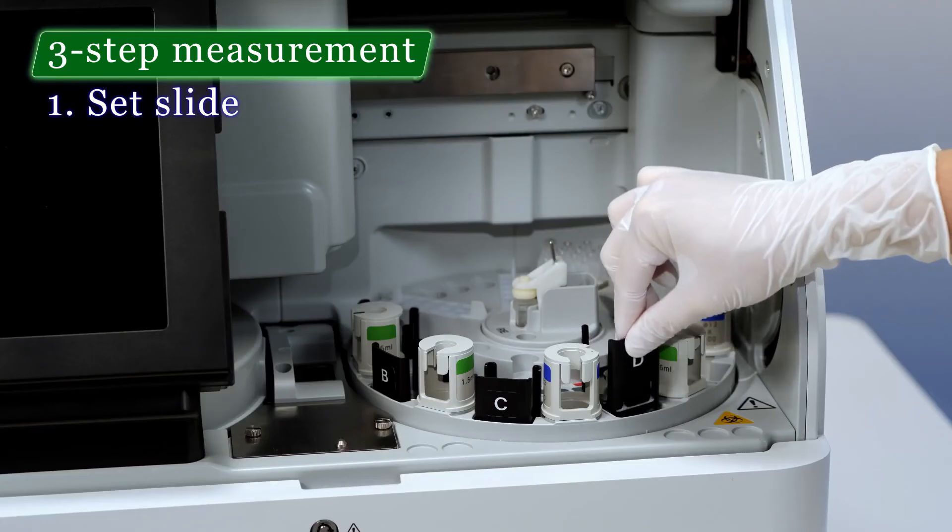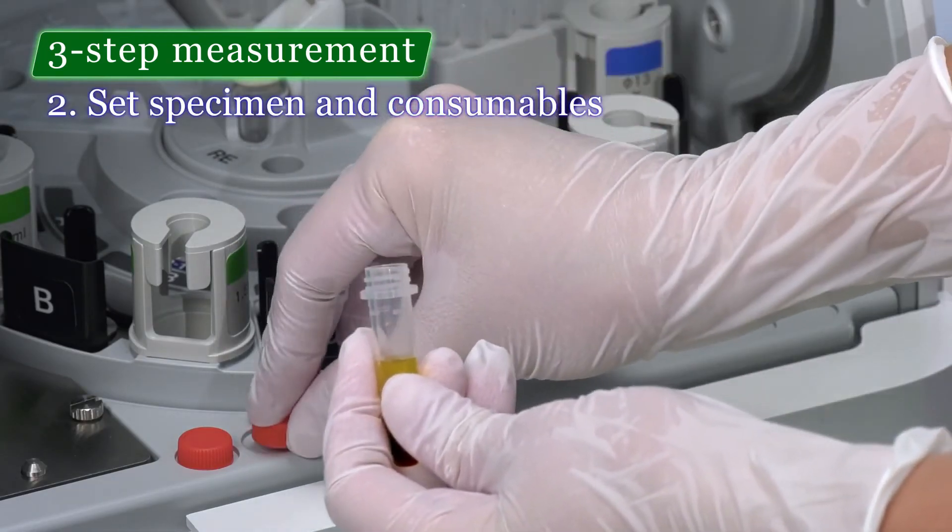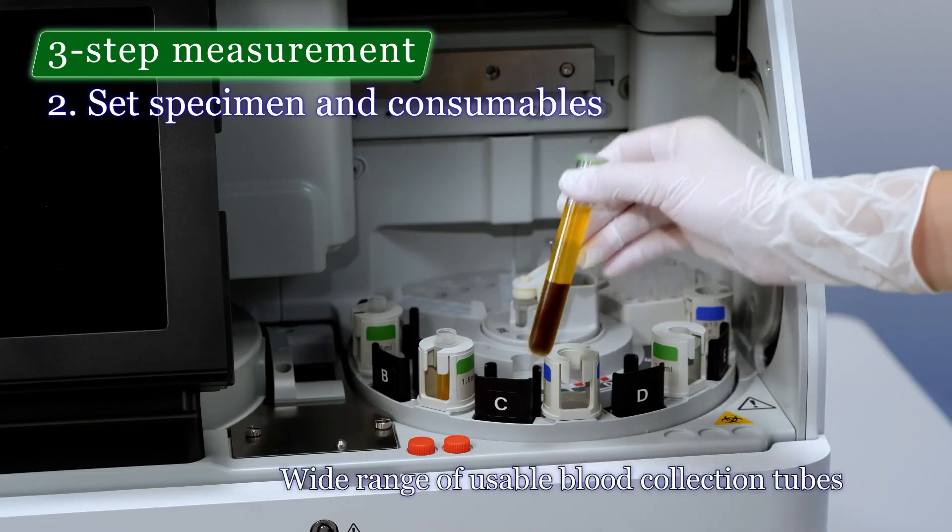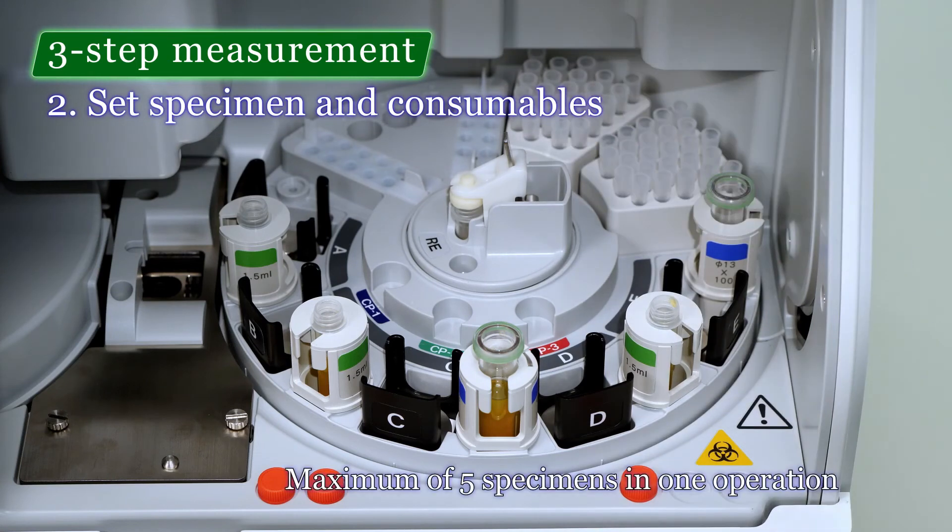The third type of biochemistry analyzer is the dry chemistry analyzers. Dry chemistry analyzers comprise highly sensitive, multi-layered reagent-coated slides instead of wet reagents. It requires only 10 to 50 microliters of a sample. The results of dry chemistry analyzers are comparable to conventional wet chemistry analyzers.